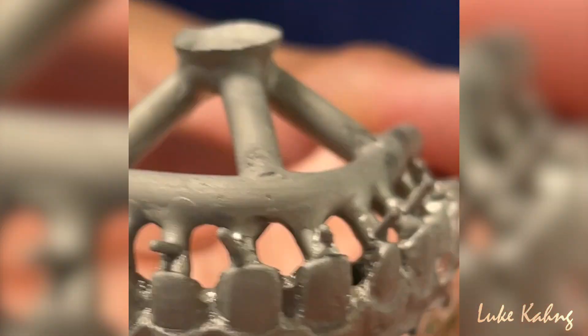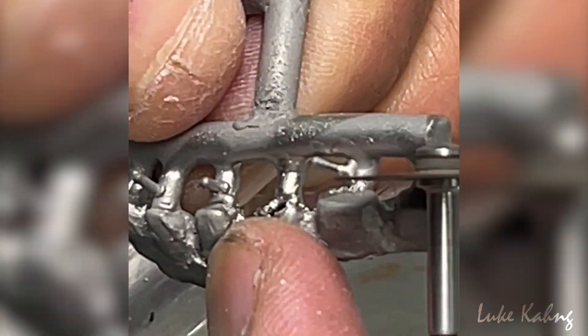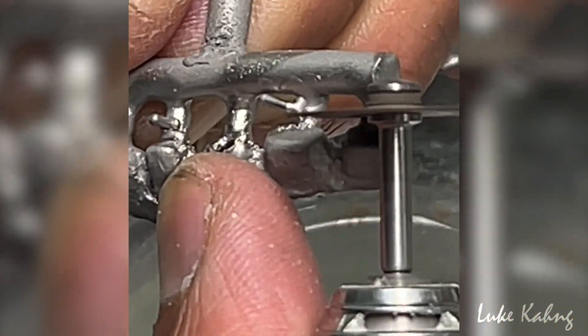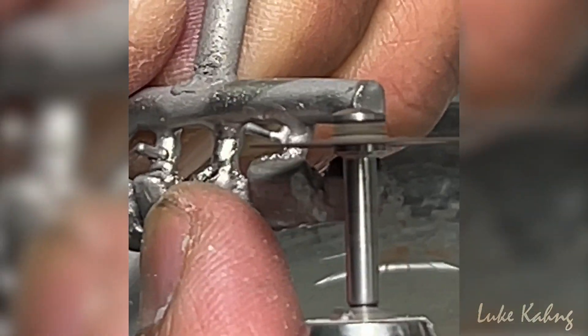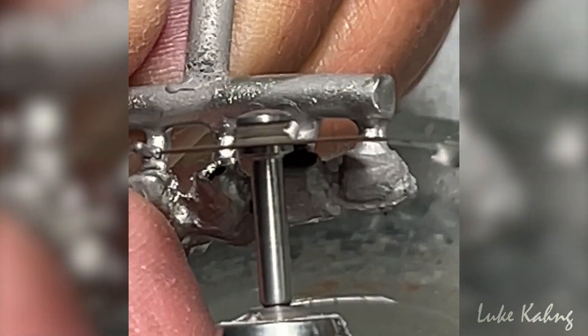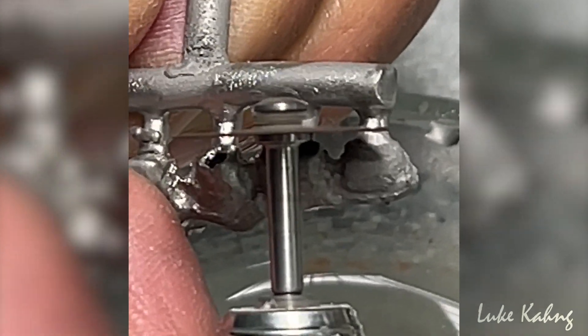Now it's cutting time — just like that one.